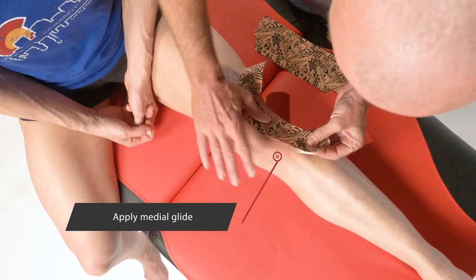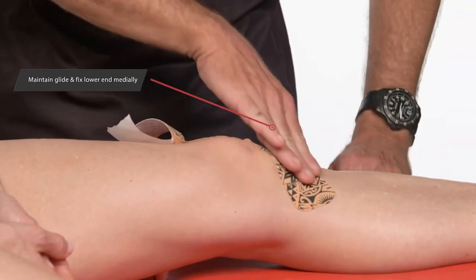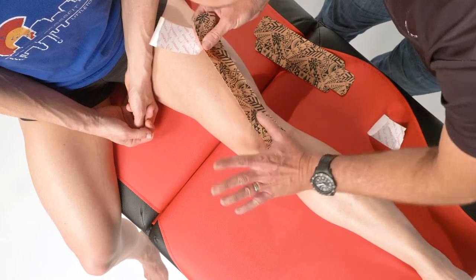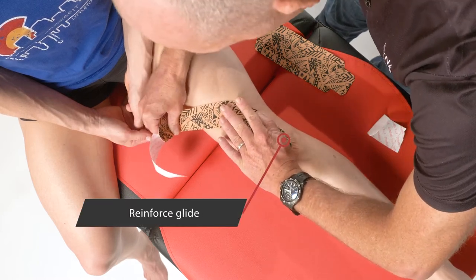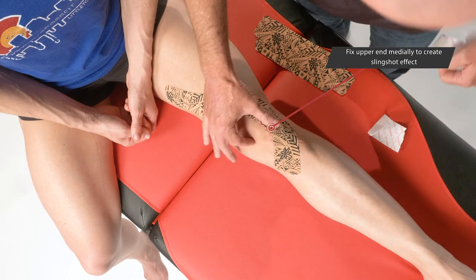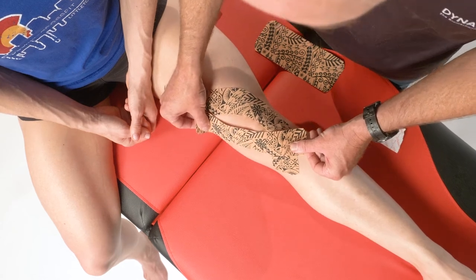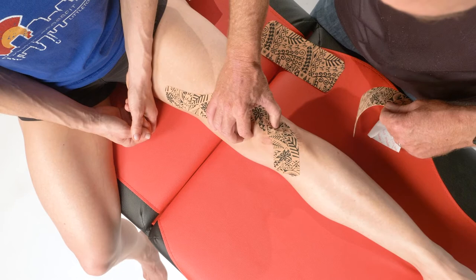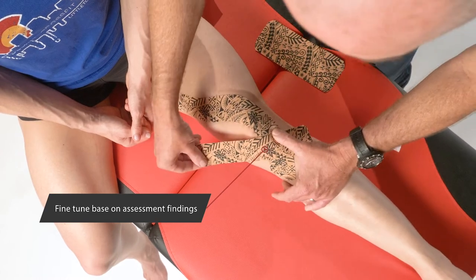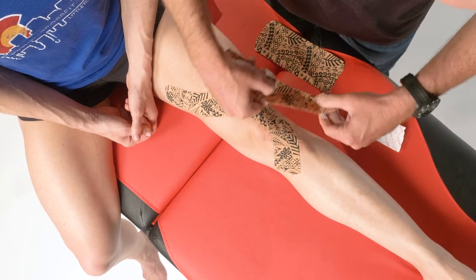Maintain that medial glide while turning this one medially, finishing with a nice anchor point at the end without any tension. Swap hands and do the same at the top — direct it medially, keep your tension on as you turn that corner, sweep around, and come up onto the adductors. You can see it starts to box up all of that soft tissue. We can maximize that soft tissue offload by coming through again. You may even want to bring in a rotation component if that was more pain relieving, by sweeping around or picking up the inferior pole to create a rotation moment at the joint.